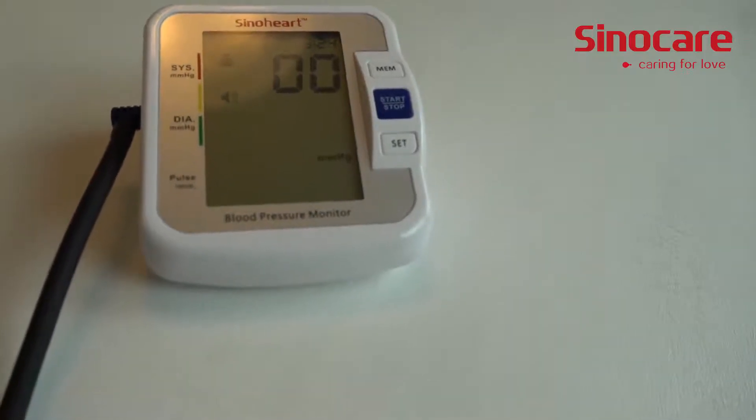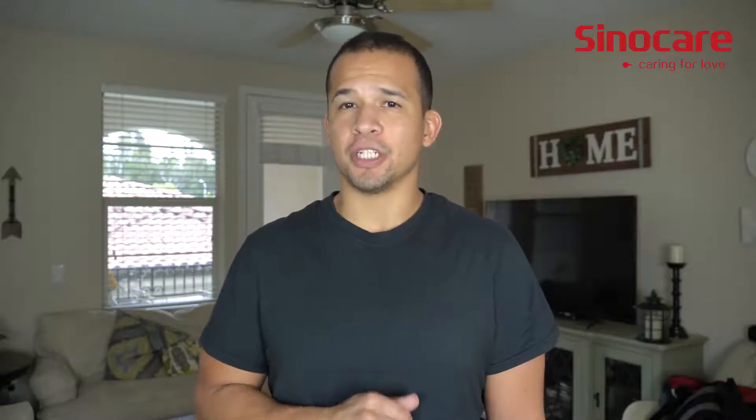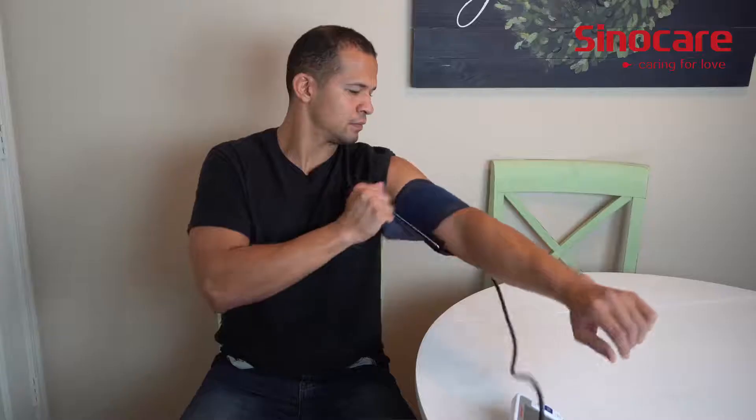Stay still and do not talk until the measurement is complete. All you do to get started is put in four AA batteries, attach the arm strap, and then just follow the voice promptings.